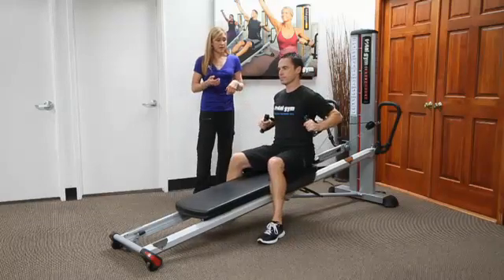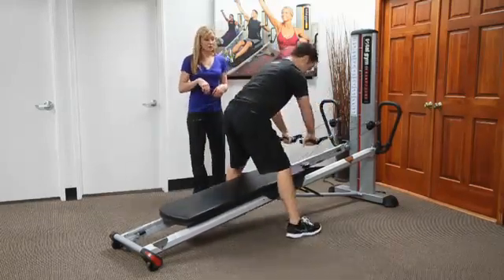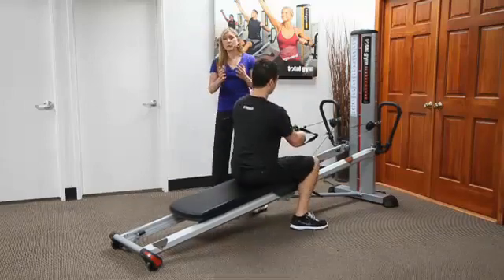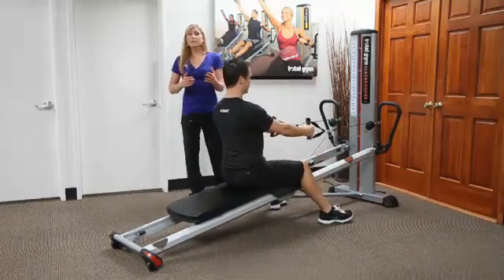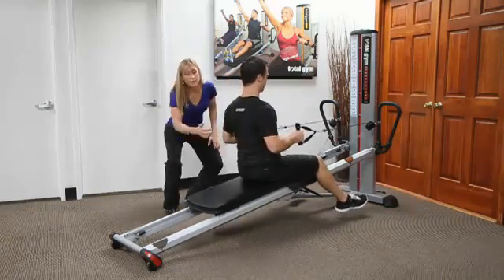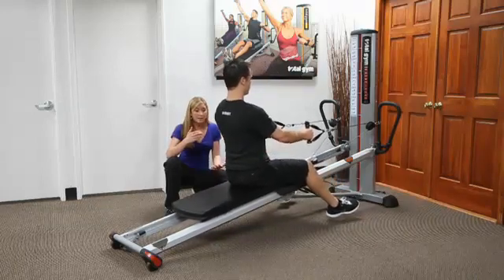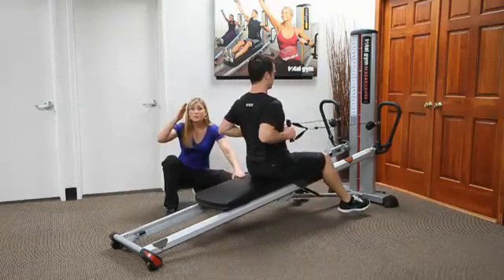So I'm going to have you stand up and you're going to turn around. When he goes to sit down, he'll anchor down, as we talked about earlier, and then he'll start just with a simple rowing maneuver. A lot of us have hamstrings that are a little bit tighter. So in this position, if I was focusing more on the alignment of the spine, I'm going to use the fact that this board moves up and down.